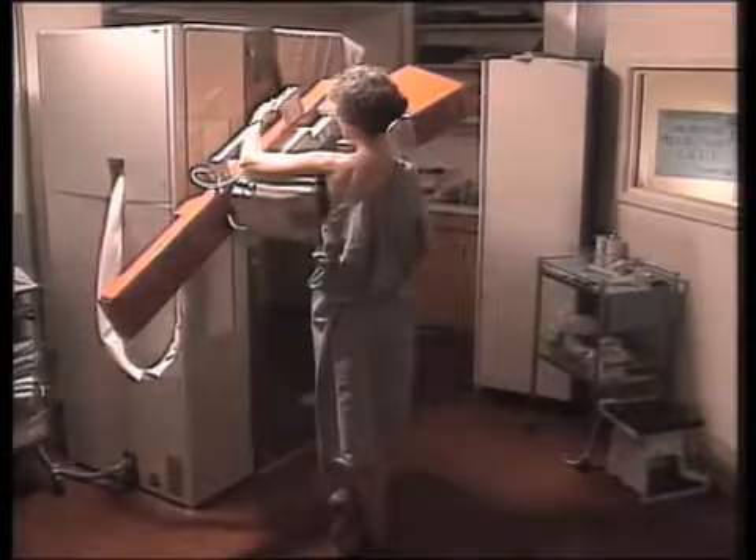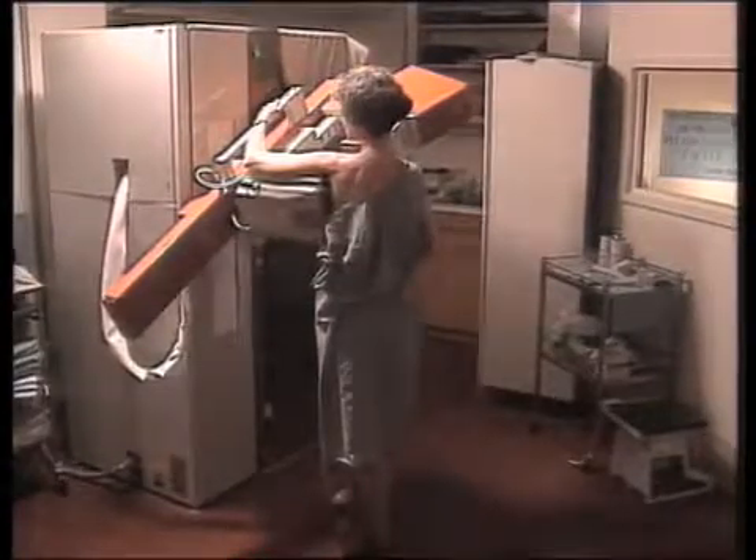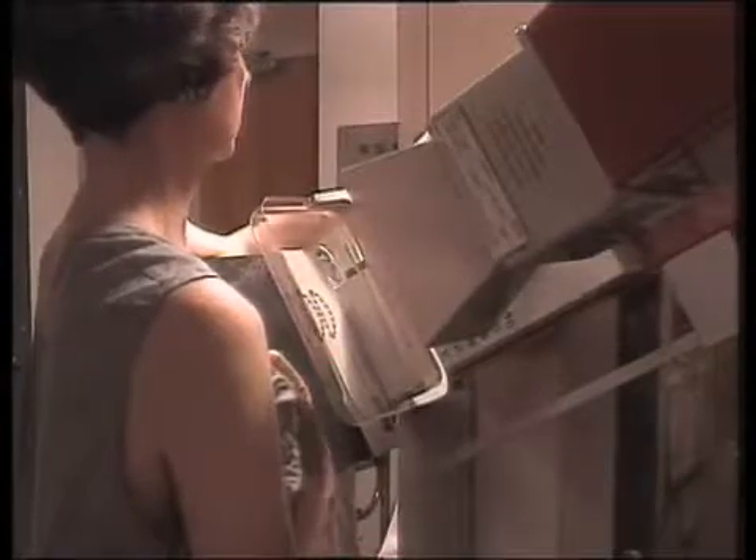Okay, well, very still. Now, stop breathing. Okay, we're all finished with that one. Step back a moment. We're going to turn the machine, and we'll do another view of the left breast.